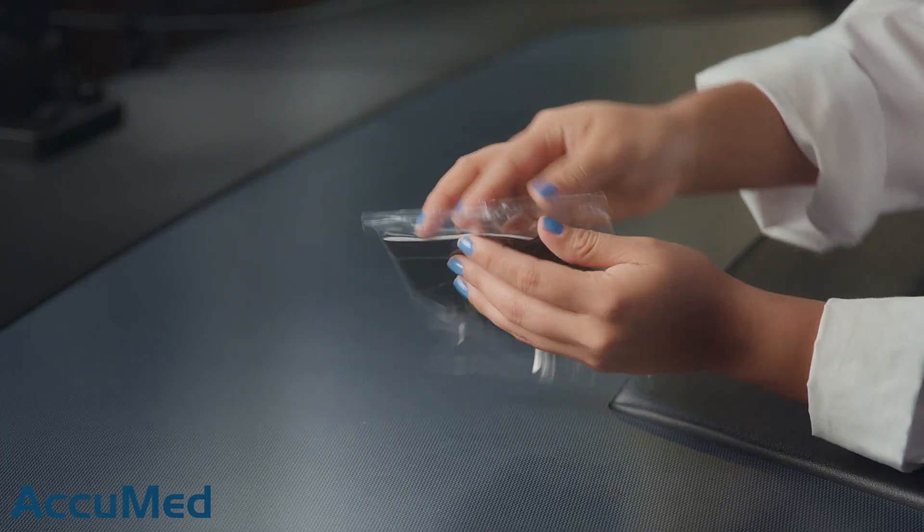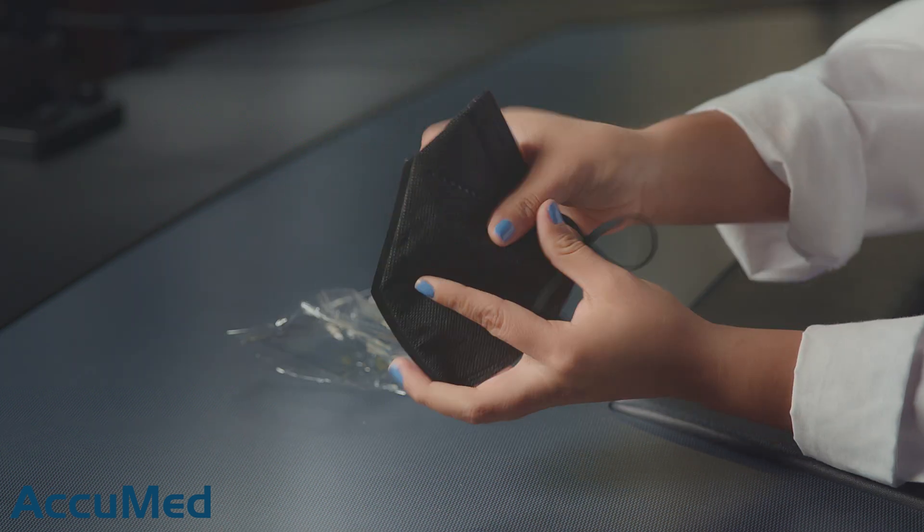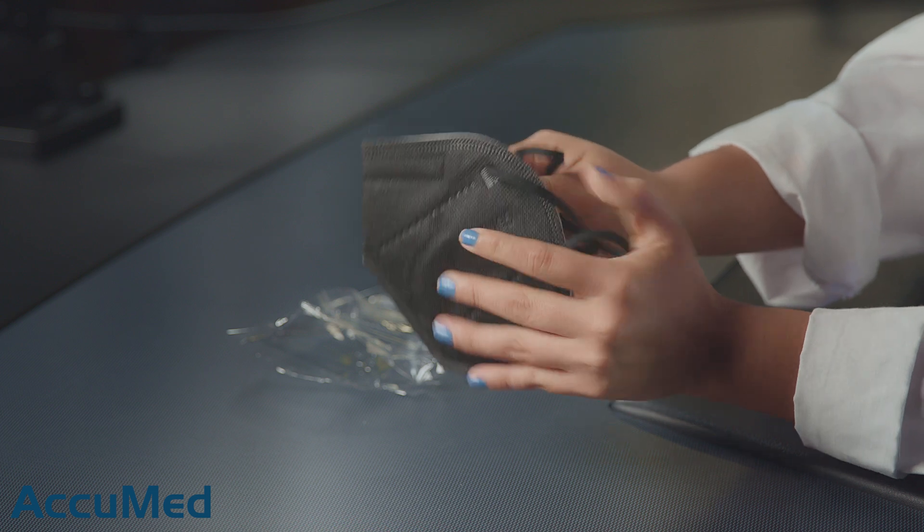Let's go ahead and take a look at these masks before we run them through our TSI machine. They do come individually packaged. Just by the feel of these, they are more on the rough side, so they don't have the best construction quality.